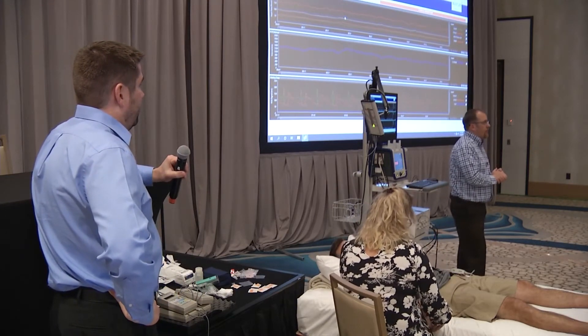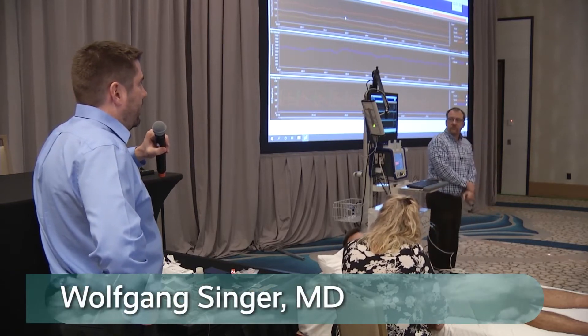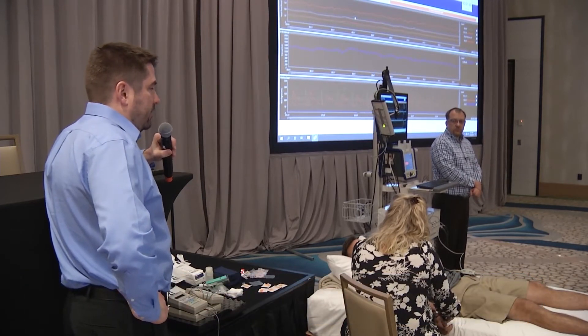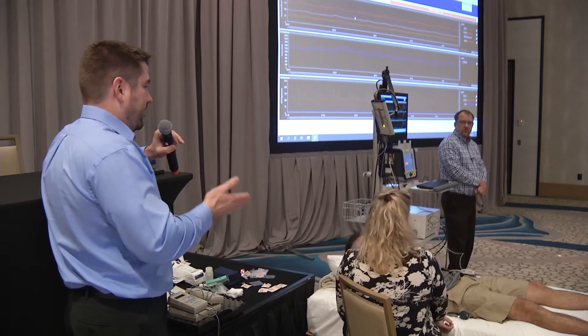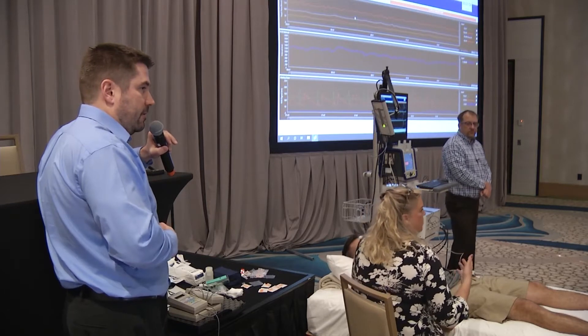The reason we take manual blood pressures is we tend not to rely on the continuous blood pressure monitoring for absolute pressures. For example, Tony is getting 120 but we're reading 150 here — this device shows trends over time and is particularly good for short-term trends like the Valsalva. But to determine whether someone has orthostatic hypotension, I would never rely on this; I always go with the manual blood pressures.